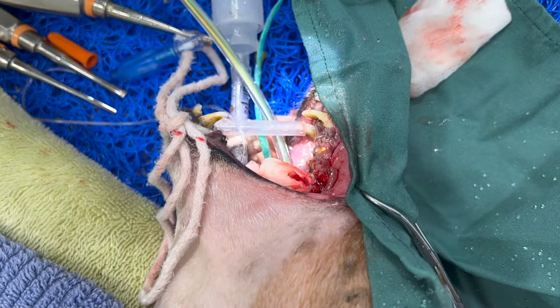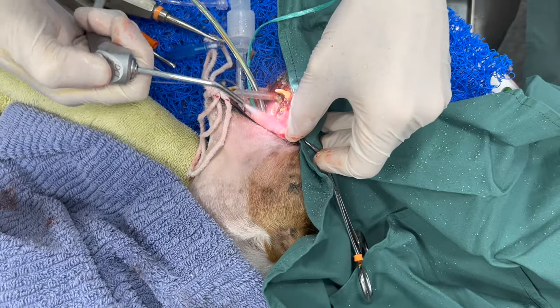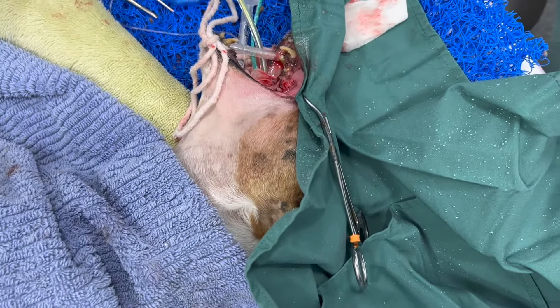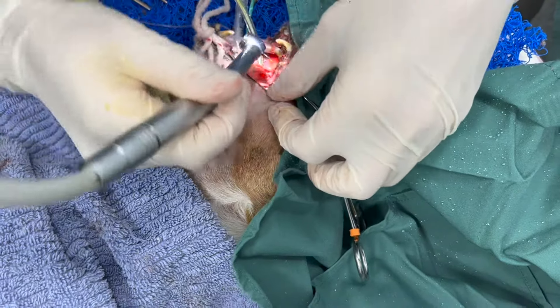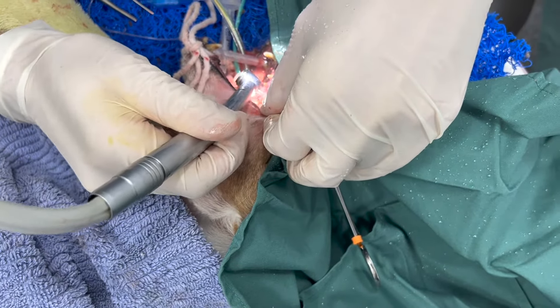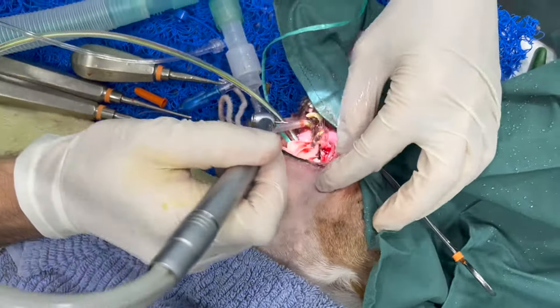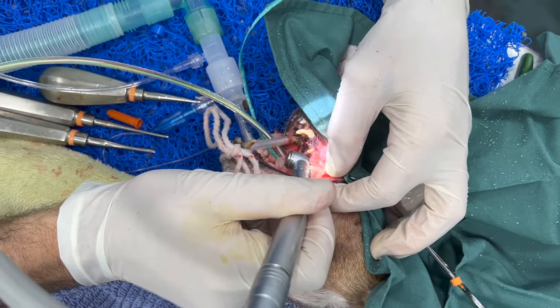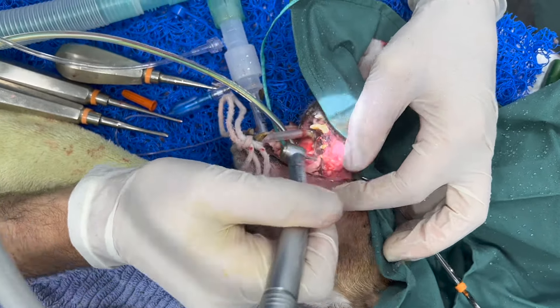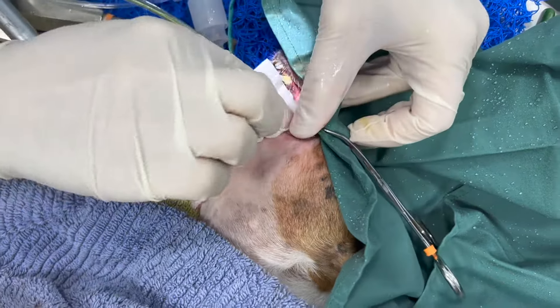Just like a human dentist, we've got a spray. I've taken out all the tooth I could see and loosen, and we'll take an X-ray to make sure it's completely out. Now I'm smoothing out the socket so it's nice and smooth and can be closed well. I'm very happy — the socket looks completely empty.